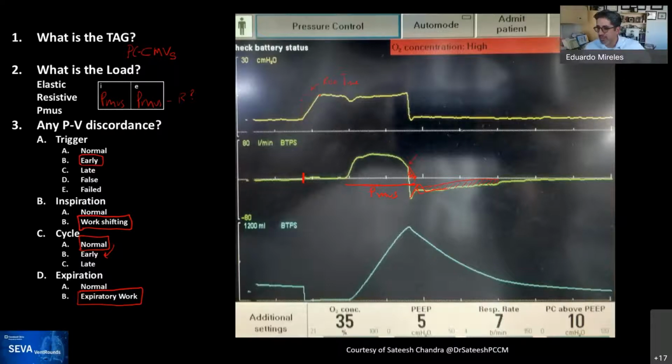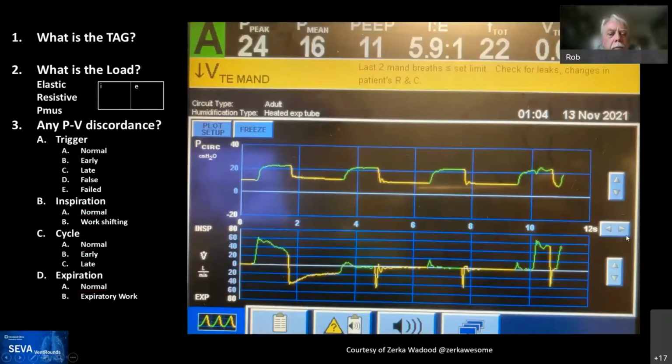Oh, so here it goes. Satish, who was taking care of the patient, said expiratory muscles were active during the mandatory breath, and expiratory muscle relaxation occurred during mid-inspiration. So, yeah. All righty.